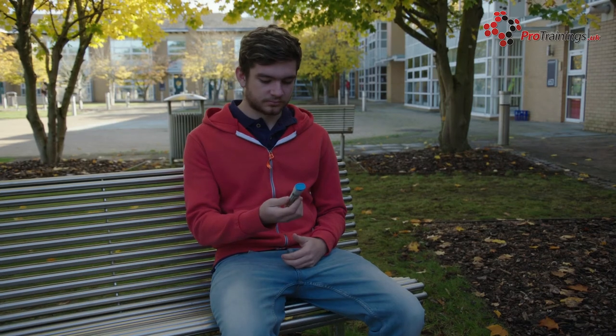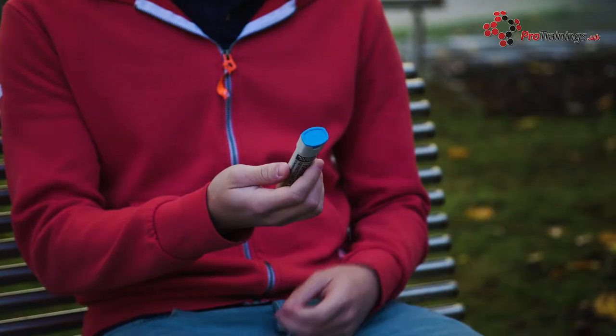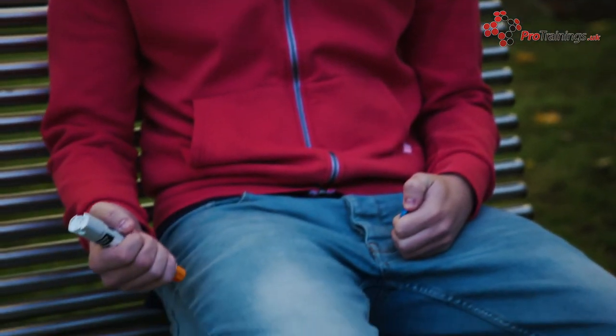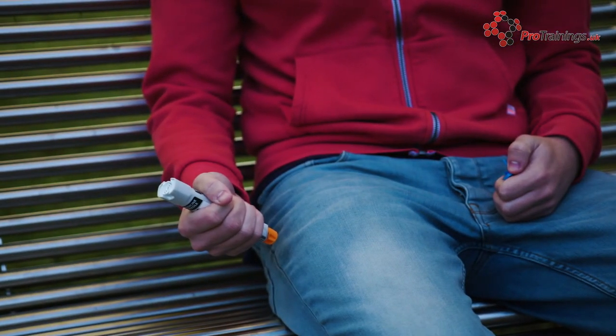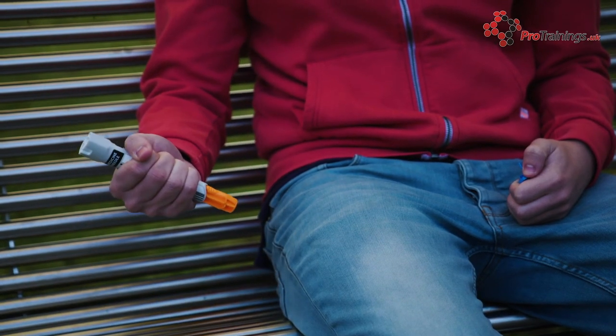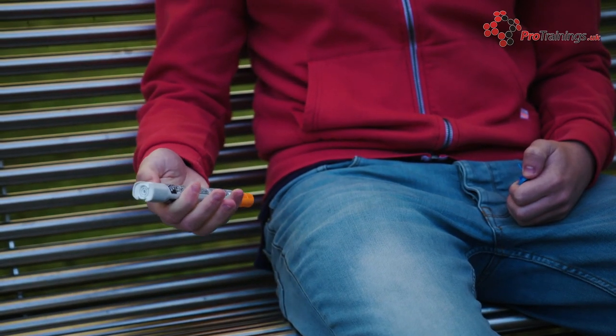When using an EpiPen, you should first remove it from its case and then sit down or lie down if you feel dizzy, with your legs slightly raised to keep the blood flowing. If you are having difficulty breathing, then just sit down. Then remove the safety cap and swing the auto-injector into the thigh, so the needle will not have to go through any thick seams or anything in pockets.